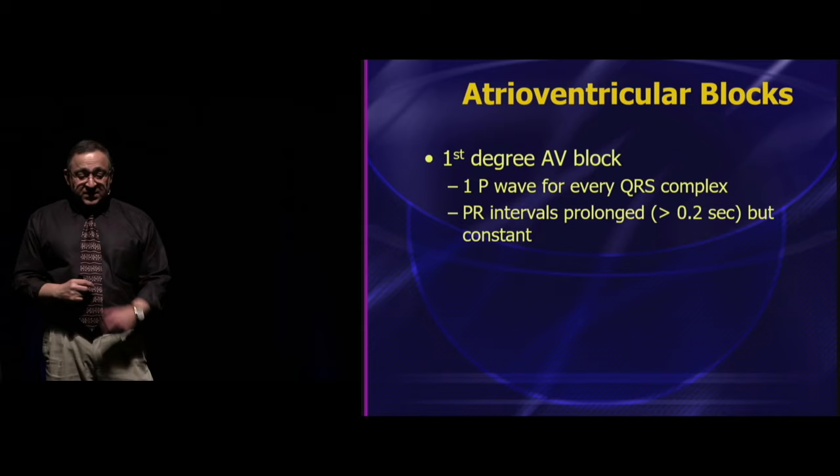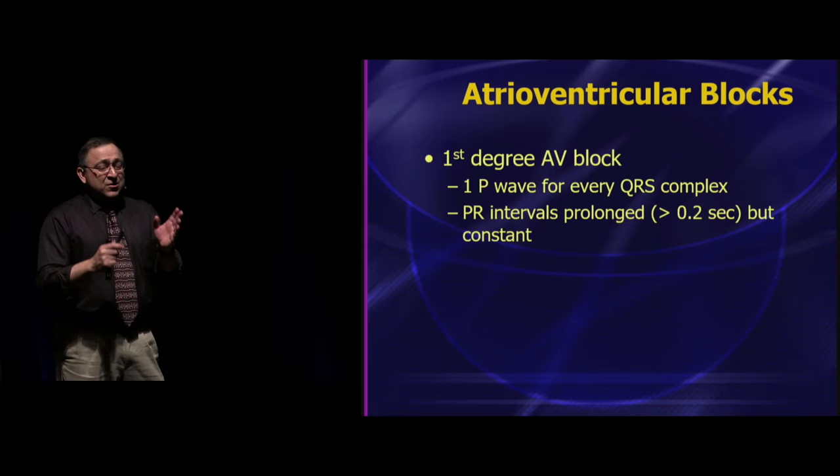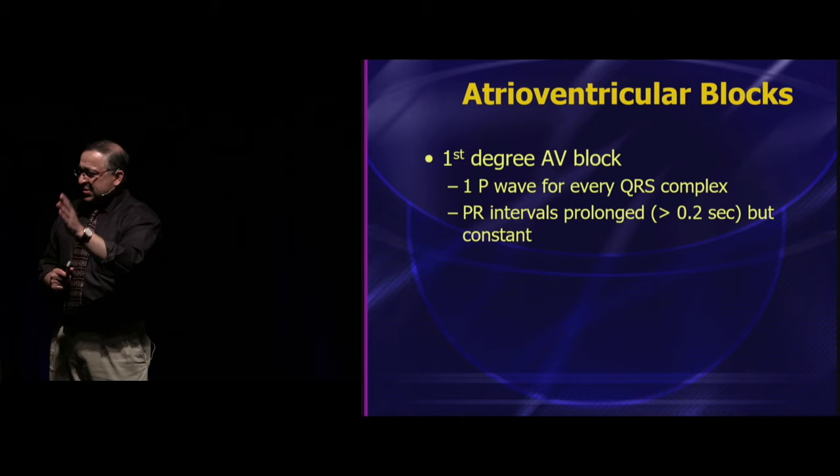Okay, so enough about those bradycardias. Then we get into AV blocks. AV blocks are a piece of cake. We're going to talk about first degree. We'll talk about second degree, Mobitz 1 and Mobitz 2, third degree.